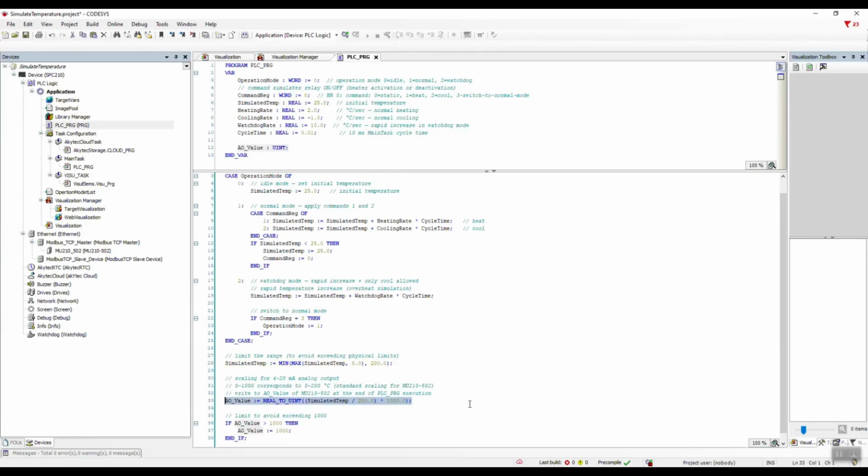The next expression converts the simulated temperature into a current in the range from 4 to 20 milliamps, where the lower limit of 4 milliamps corresponds to 0 degrees Celsius, and the upper limit of 20 milliamps corresponds to 200 degrees Celsius. We multiply this expression by 1000 because the control signal range for the analog output takes values from 0 to 1000, where 0 corresponds to 4 milliamps and 1000 corresponds to 20 milliamps.